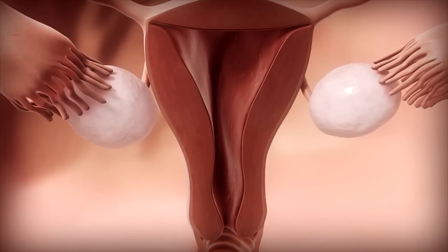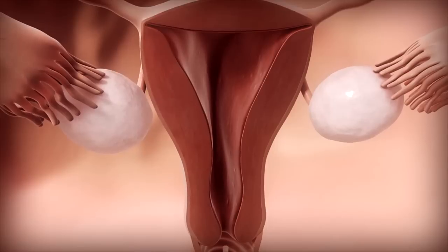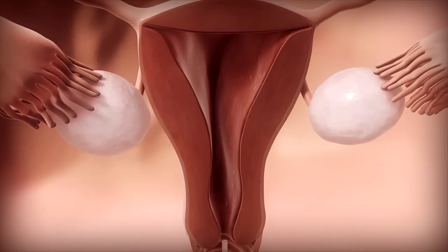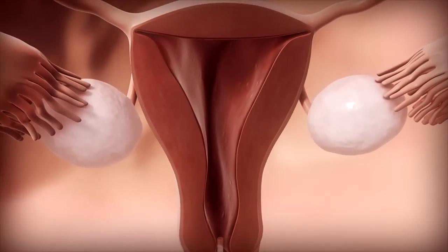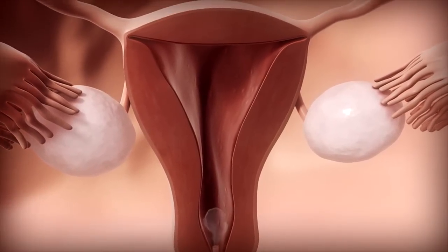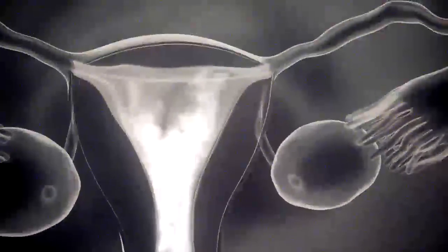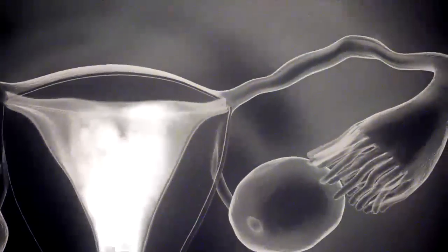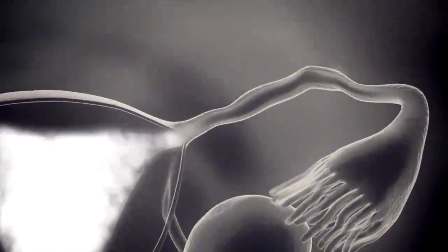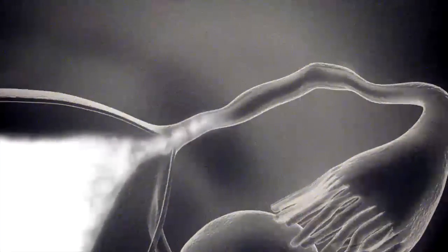In HSG, a thin tube is threaded through the vagina and cervix. A substance known as contrast material is injected into the uterus. A series of x-rays, or fluoroscopy, follows the dye, which appears white on x-ray, as it moves into the uterus and then into the tubes.